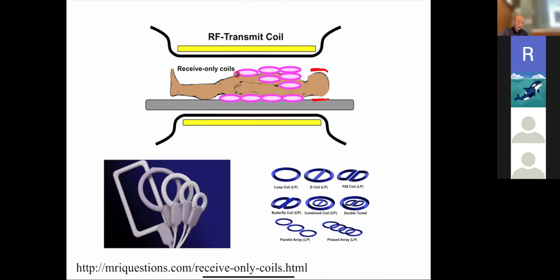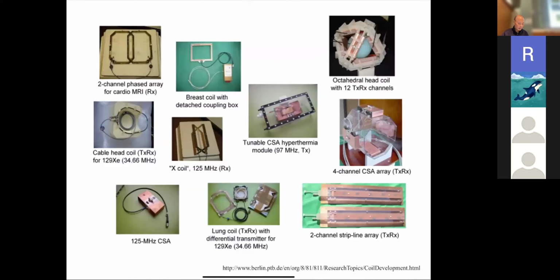And these coils look like this. And so the nice thing is now you can start thinking of locally receiving. And as you get closer to the body, then your sensitivity to the signal also increases. These are just some examples. These are homemade examples. They're not clinical examples, but you can see they're all fairly simple. It's just a bunch of copper and typically some capacitors and resistors, and you're just trying to tune it up to receive the energy.